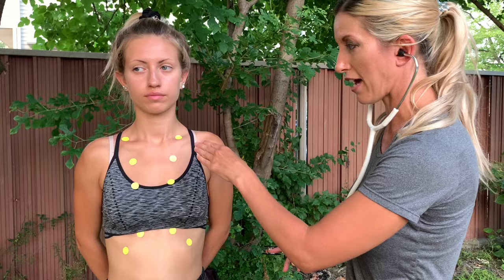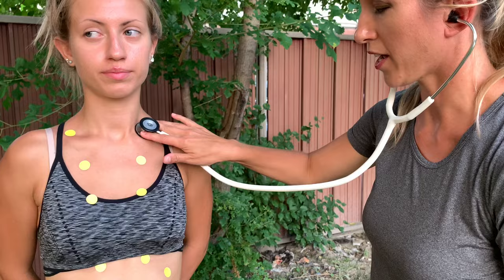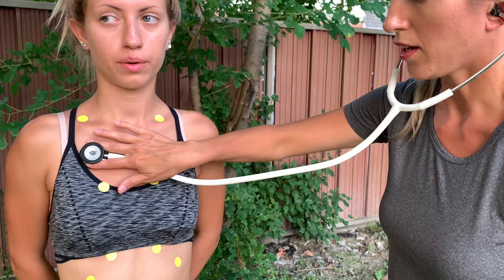You're going to start above the clavicle on each side and have the patient breathe in and out. You just kind of ladder back and forth. You do want to check with your patient — make sure they're not getting dizzy from blowing off too much CO2.